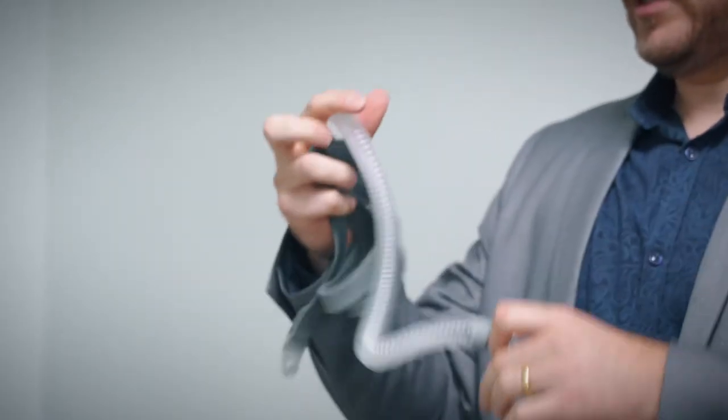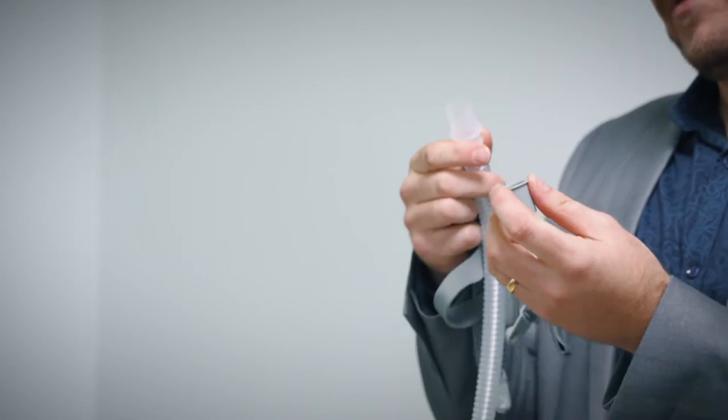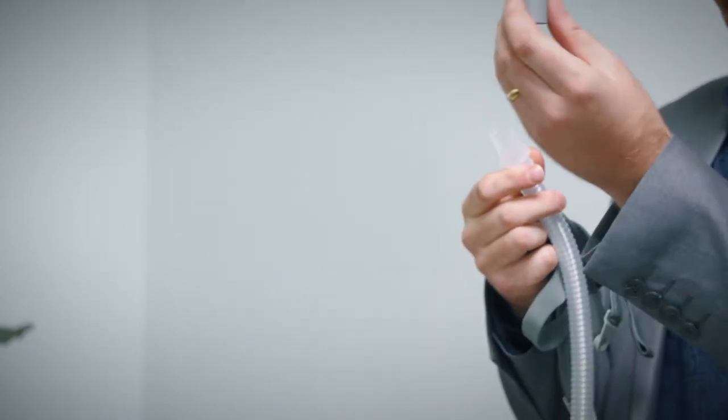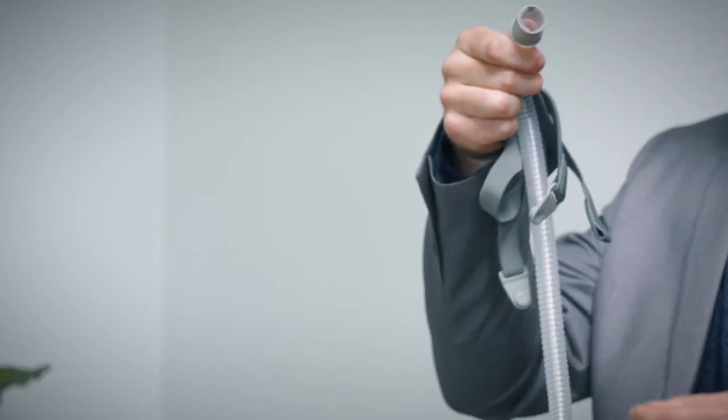You've got a short tube on the mask and at the bottom of that you've got this part here which comes away. If you get up in the middle of the night to go to the bathroom, this part here will stay in the tube so you can just quickly release it and then come back and reconnect it.